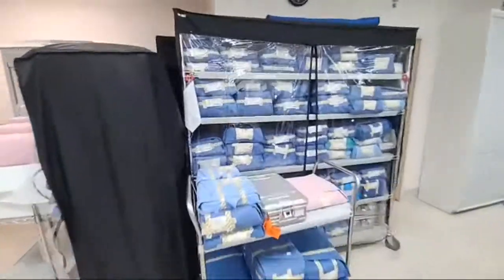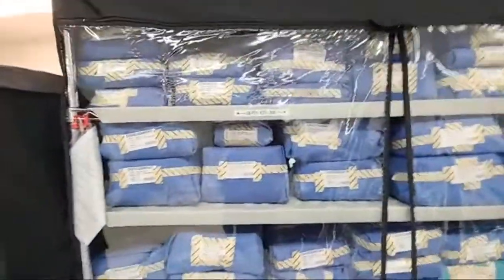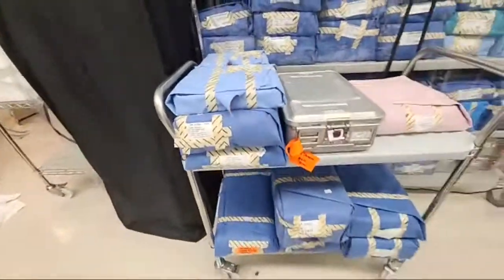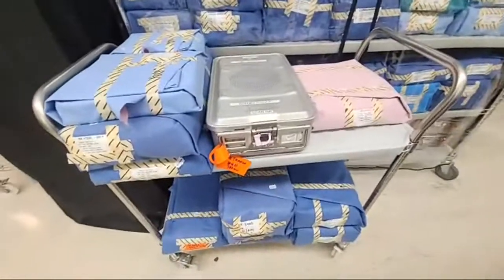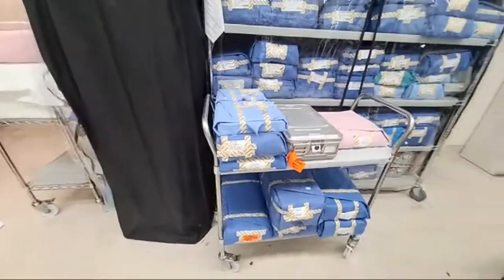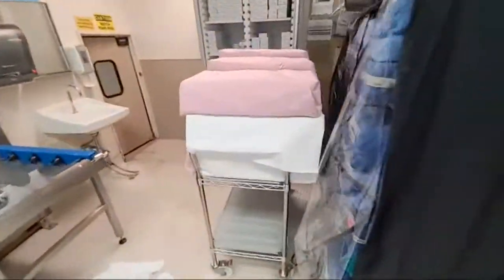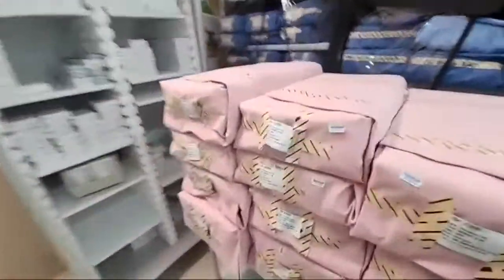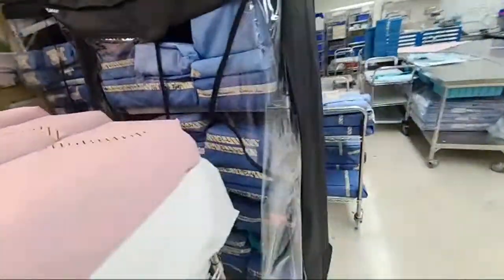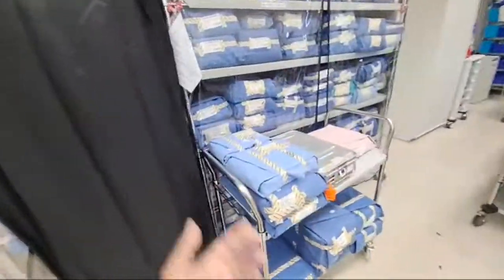Let's see. Here are your loaners. So we have loaners that stay on site, obviously. Certain companies we keep on site. These are out because they are ready for, you can see, well, I don't think I should let you see, but they're marked on it for when the surgery is first thing in the morning, whether it's tomorrow or in 2 days. They are set out and ready for the vendors or any personnel who's running that surgery to come here and pick up.